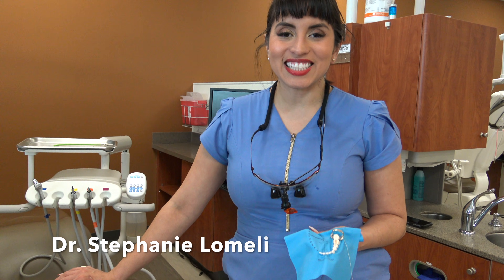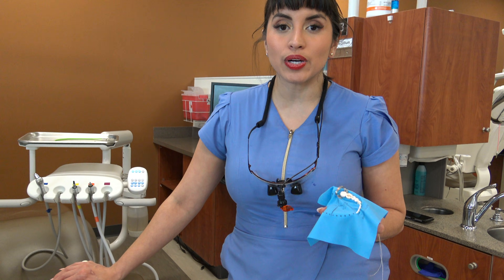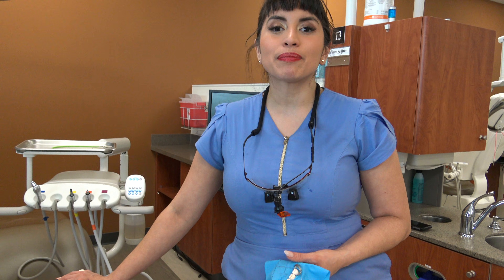Thank you for joining us today on this class 1 restoration and occlusal composite restoration. Please join us for future videos and good luck!